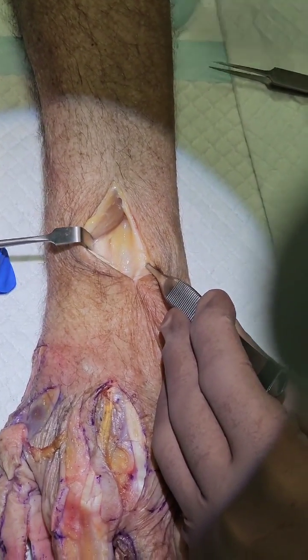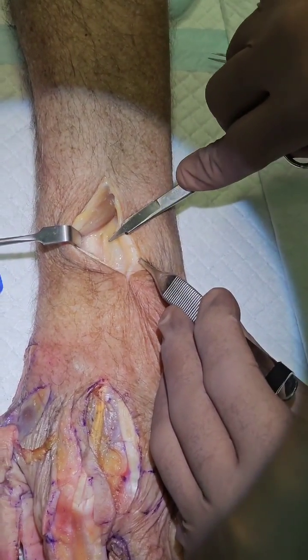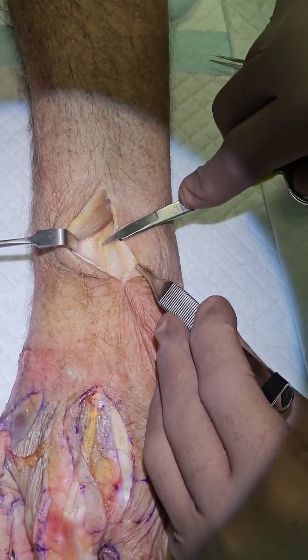Scissors please. And there you are — the posterior interosseous nerve.